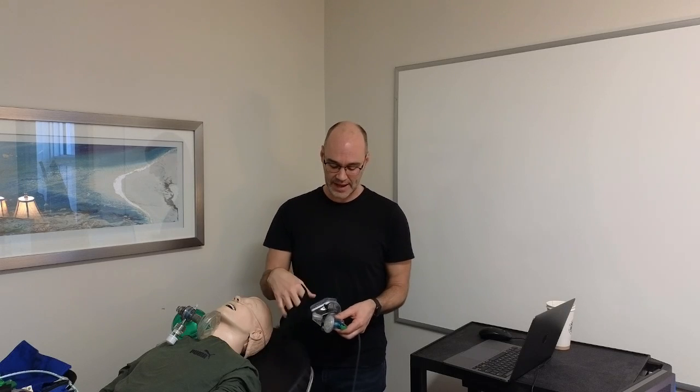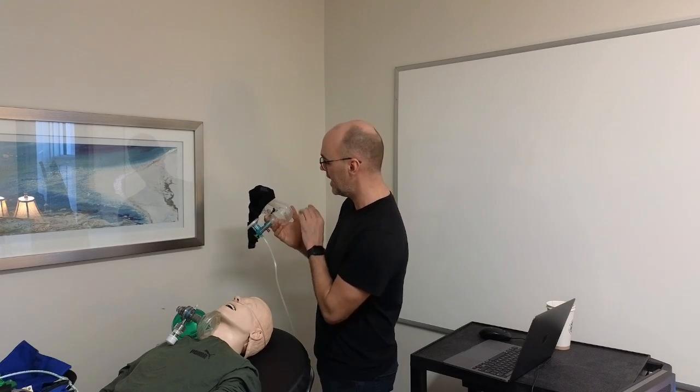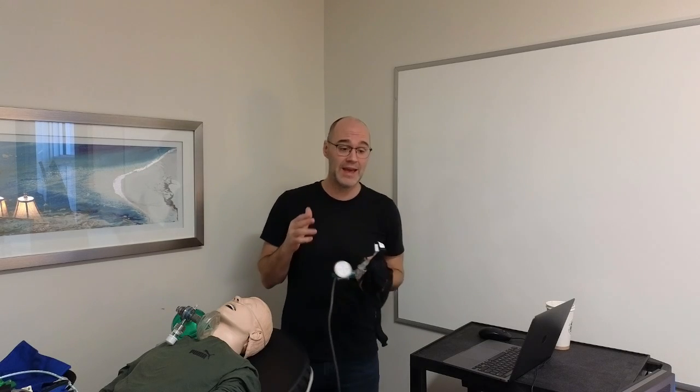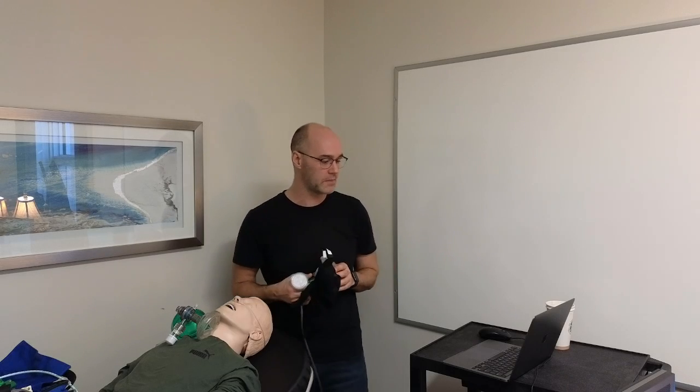Now, when we talk about CPAP, we're talking about continuous positive airway pressure. If we take a device like this, for example, and apply it to the patient, it's going to push a gas up into the device, and as the patient breathes out, given that we have a perfect seal on the mask, we're going to create some positive pressure inside this system. It's applied during the entirety of the respiratory cycle, so not just during inhalation, but during exhalation and during respiratory pause. So, continuous positive airway pressure. It's generally applied starting off at 3 to 5 centimeters and then titrated up to a max of 20. It can go above, but typically we wouldn't, and often 5 to 10 will work for most patients. It will be increased based on its effects on the patient.